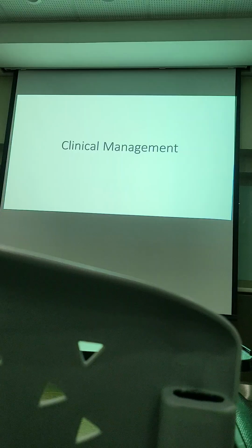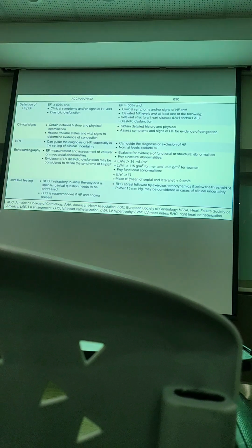Okay, clinical management, I won't go too much. Basically, just know ProBNP is helpful. Patients can have symptoms of reduced effort tolerance or even overload symptoms, kan? So sometimes when you get an echo request to rule out for diastology assessment, tak salah lah if you want to ask the doctor how's the ProBNP, kan?